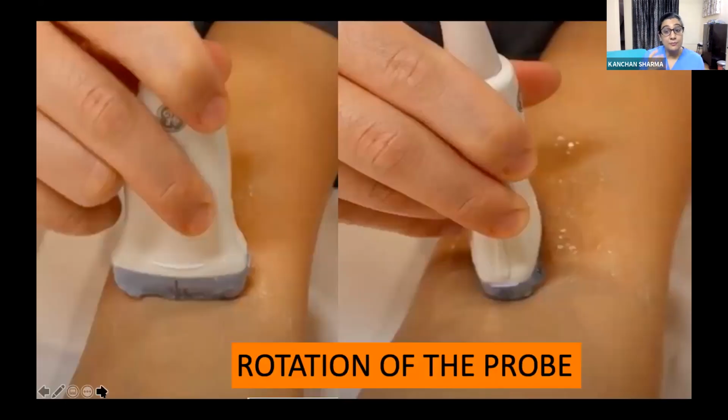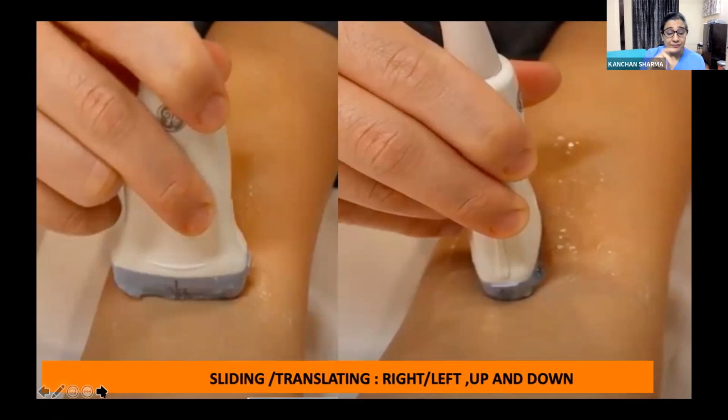Fine. Certain probe maneuvers which you should know. When I'm saying I'm rotating the probe, it means I am changing its axis from long to short or from short to long. So whenever during demonstration I say that I'm rotating the probe, you should understand that now I'm changing the axis of the probe, right? There is something called sliding the probe.